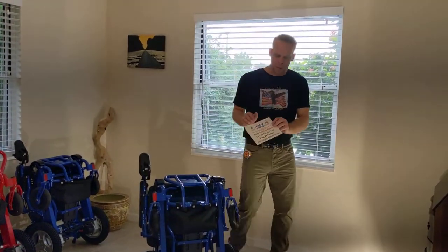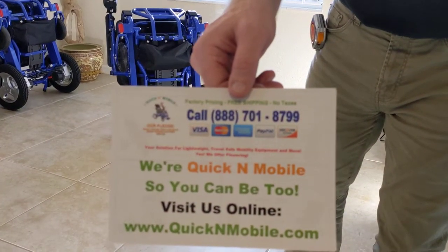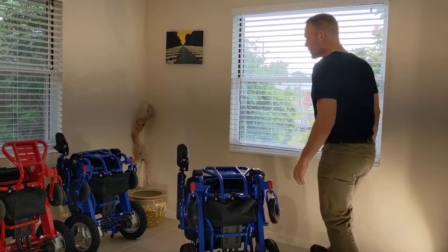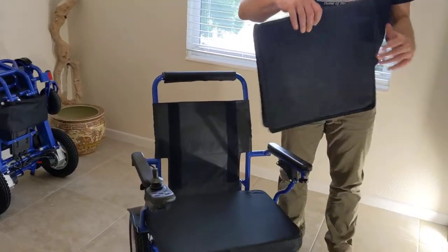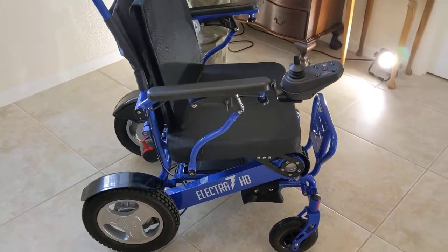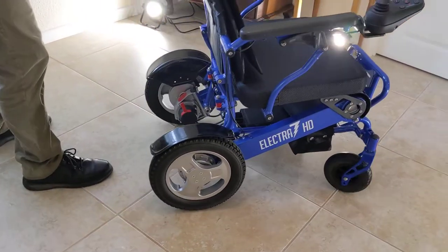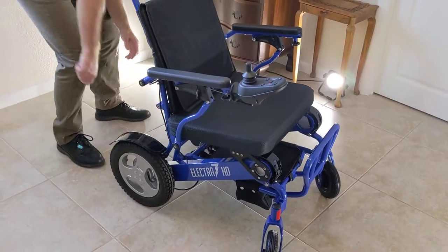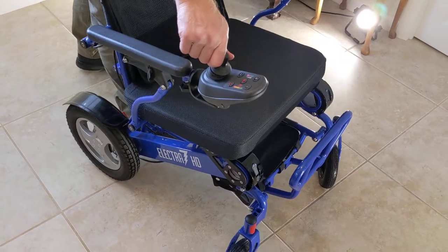Hello, this is Paul from QuickenMobile.com. Let's take a look at this chair right here, the Electra 7 power folding wheelchair, direct from the factory. We took the backrest off before we get into the chair. The chair unfolds very easily in freewheel mode, and it has the ability to lock into space and become a power chair.